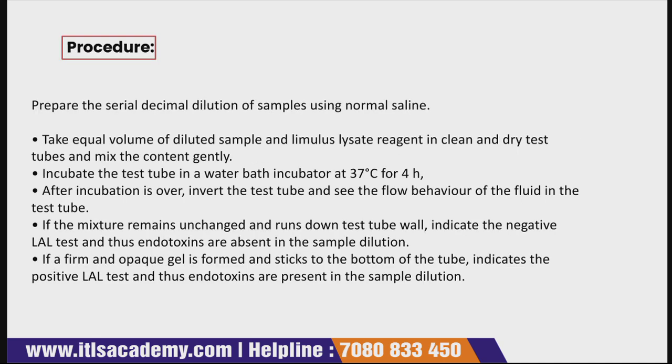So what is the procedure? Prepare a serial decimal dilution of the sample using normal saline. Then take an equal volume of the diluted sample and the Limulus Lysate reagent in a clean and dry test tube, and mix the contents gently.